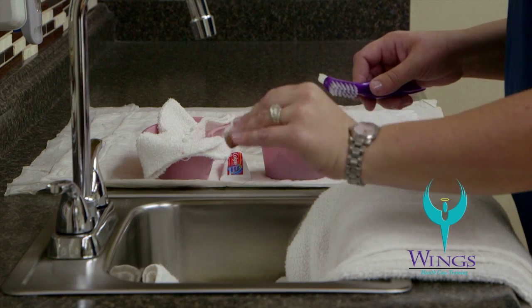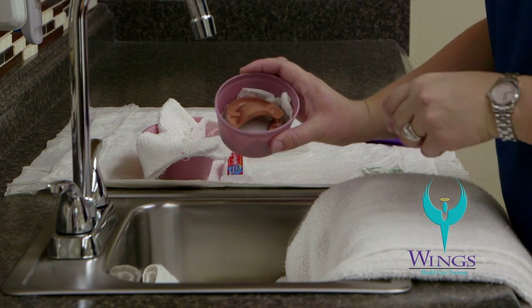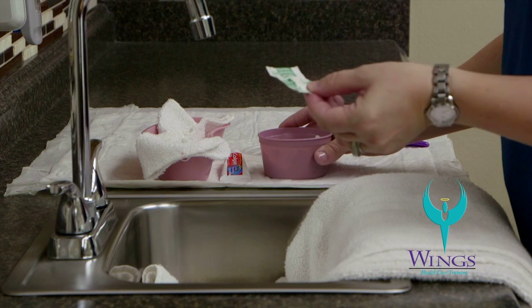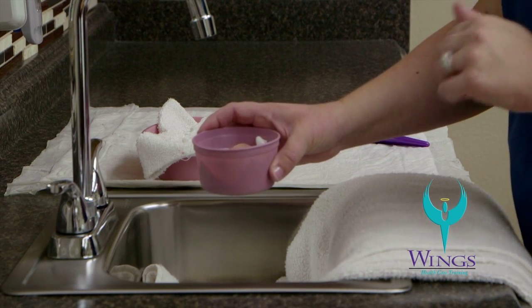Rinse the top plate with cool water. It will also get placed in the denture cup, teeth side down. Place a denture tablet inside the cup underneath the dentures and fill the cup with cool water.